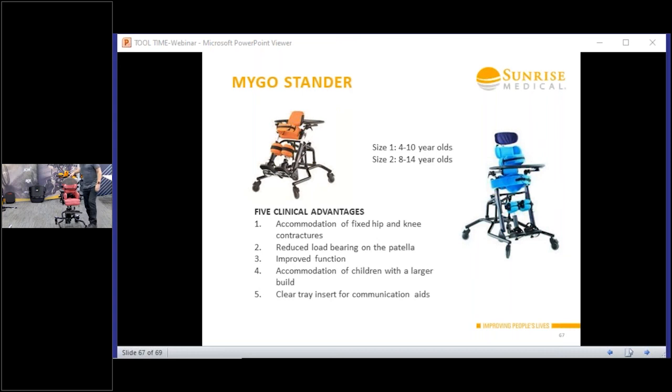So they're not brakes. So you only get 2 brakes. What they're doing is, going down corridors, it's actually going to walk a lot neater, so it's a lot easier to propel. So you've got the carers walking down corridors or parents at home having that a little bit easier, as opposed to if you go, depends how you're pushing them. So then you've got 4-wheel turning. So it all depends on the environment. You just turn them off, turn them on. The 2 brakes at the rear do hold it really steady as well.